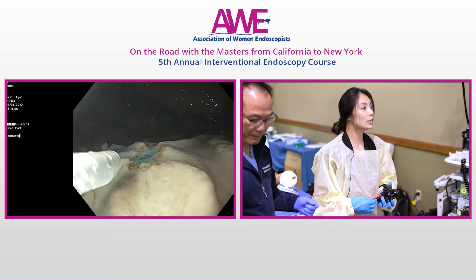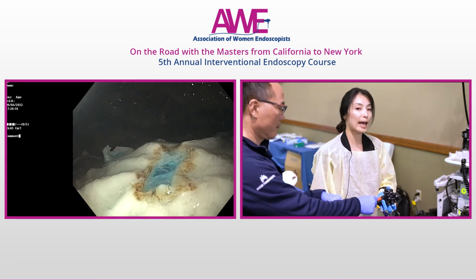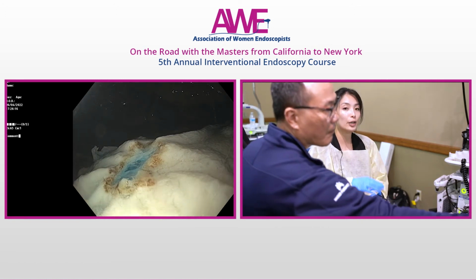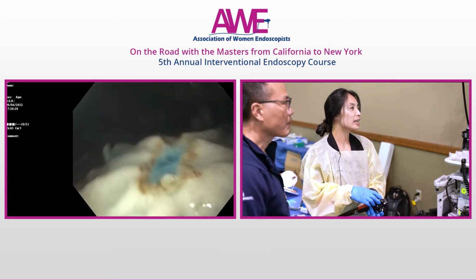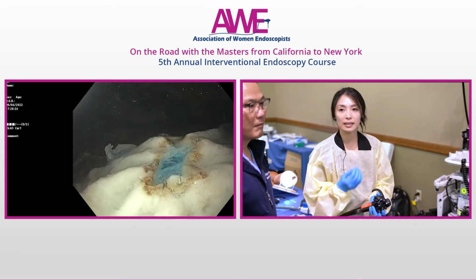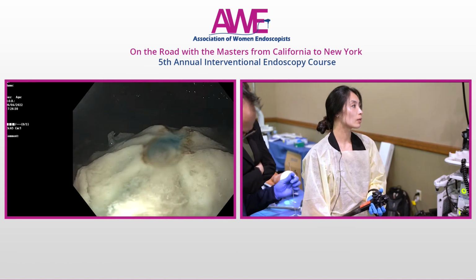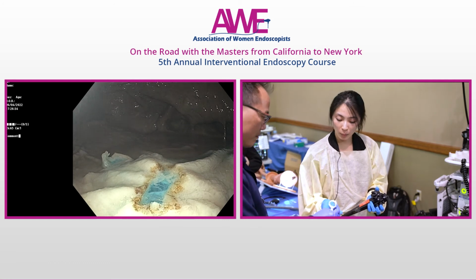So it's not forming a gel here, but what you would see normally is you would actually see a layer of jelly-like tissue over the defect. And the idea is that that jelly would form an adherent matrix, and it would last for, I think, at least 3 days. And that would prevent delayed bleeding and delayed leaks, and it would assist with healing. And if our participants can go to the virtual exhibit hall, we actually have some links to see how the device works when the blood is there.